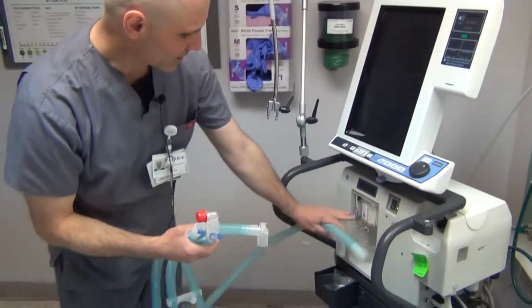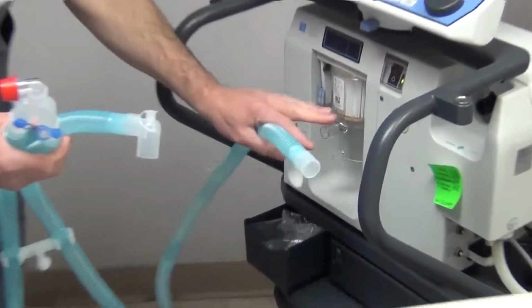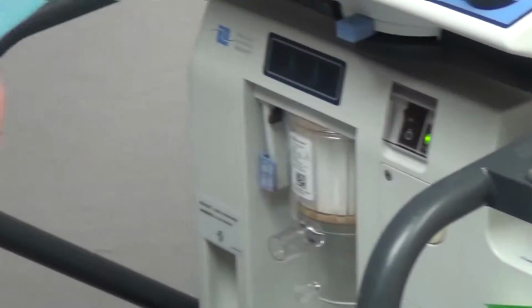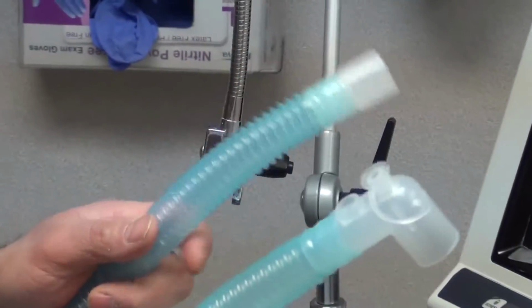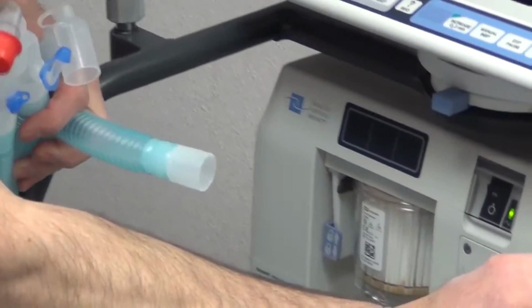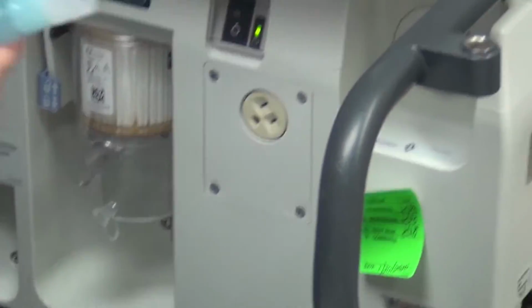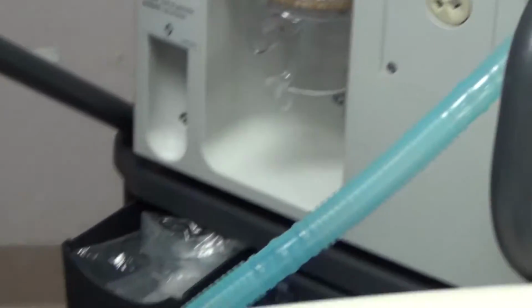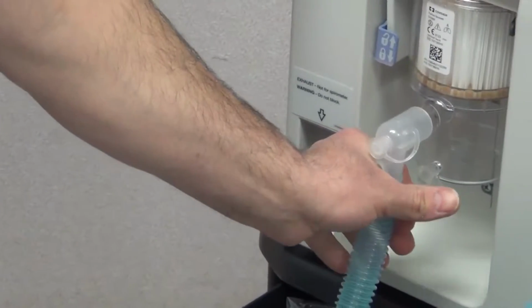We need to plug one here for the exhalation, and we need to plug one of the tubings here for the inhalation. It does not really matter which one you use, but for ease of purpose, since this inspiratory port is indented, I'm going to use a straight one. Then I'm going to plug in the other one into the exhalation port.